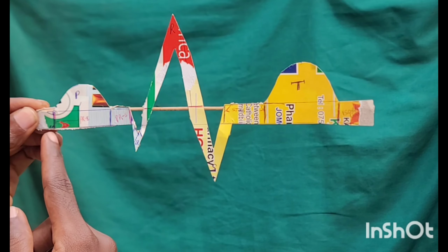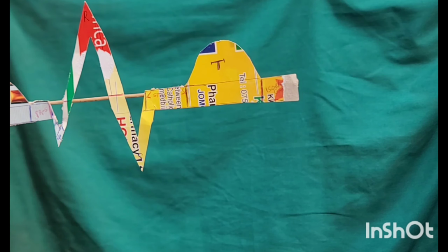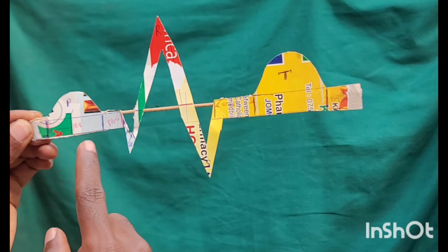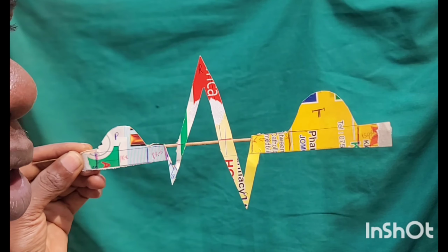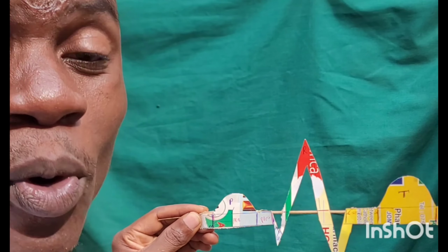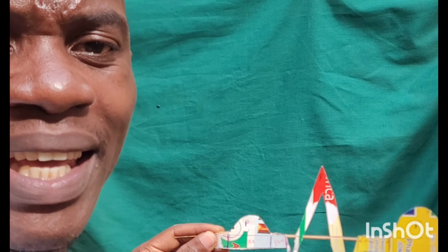It is also such another beautiful thing, and it takes on average 0.12 to approximately 0.2 seconds, because the whole of these waves is supposed to take approximately 0.8 seconds. That's the normal time taken for one complete cardiac cycle.